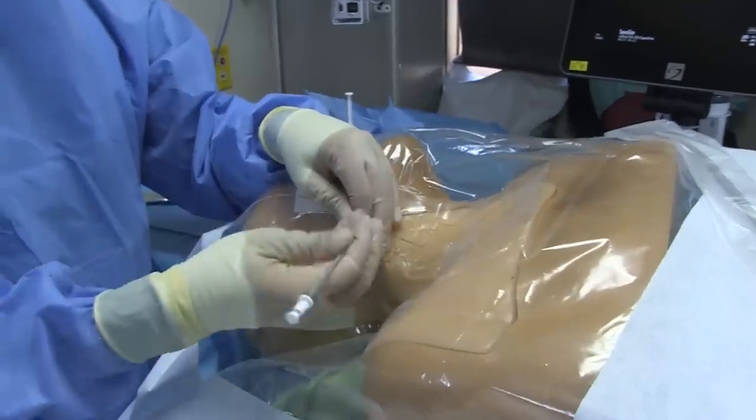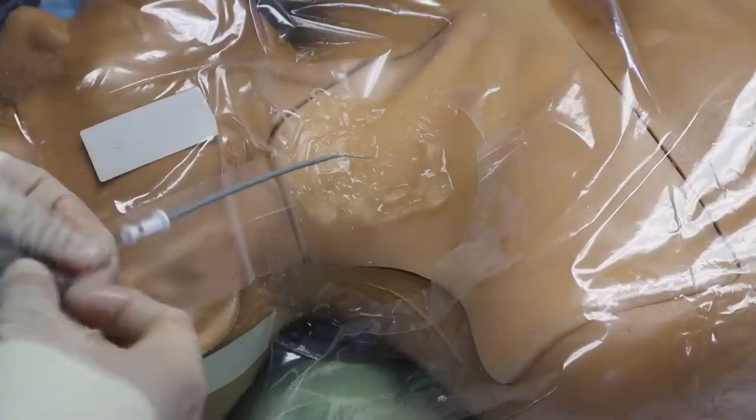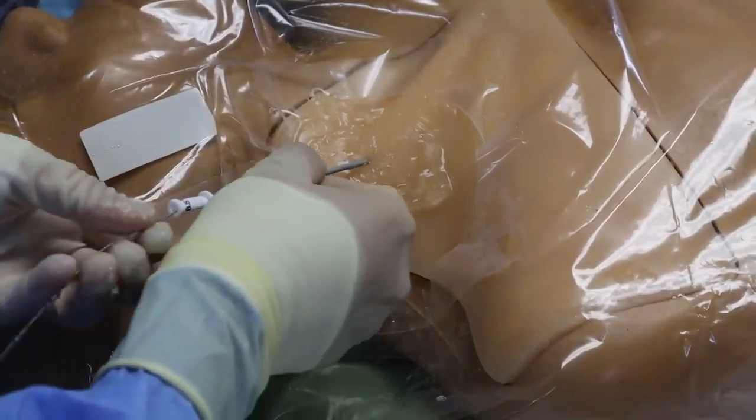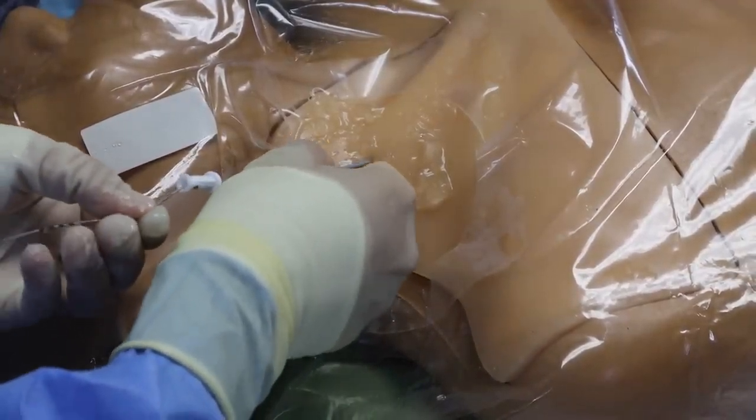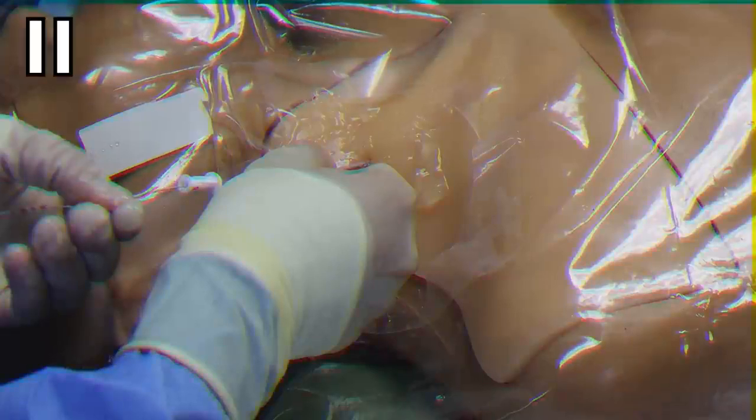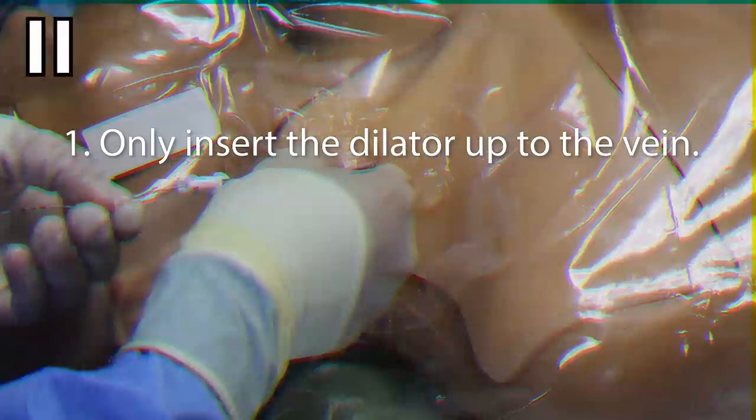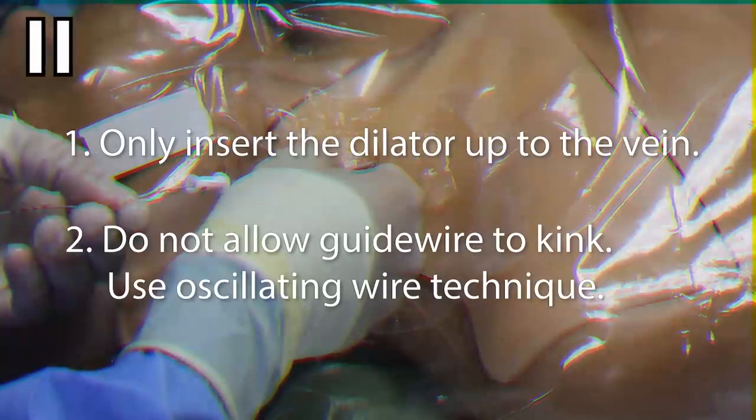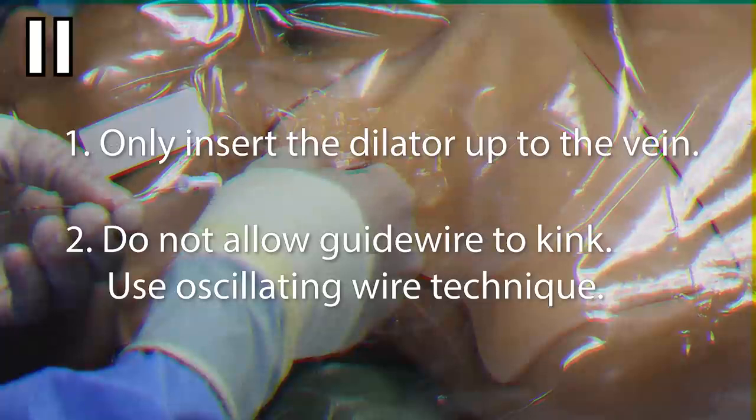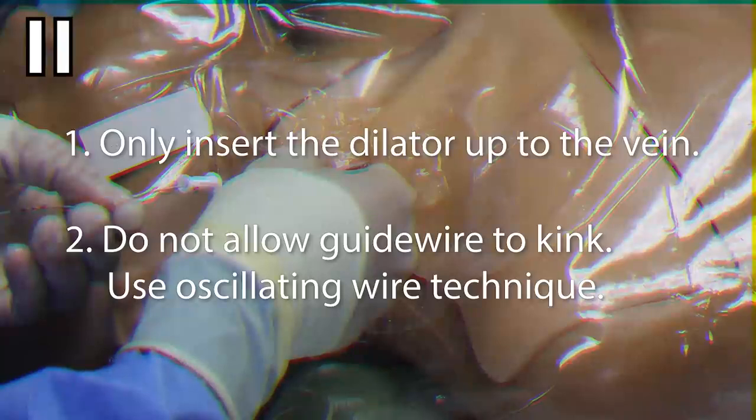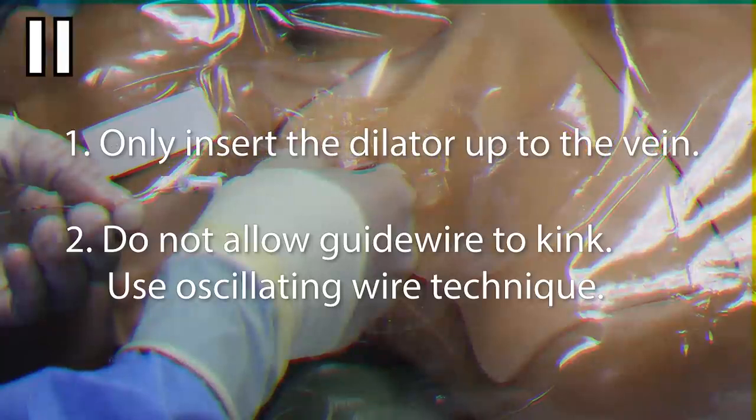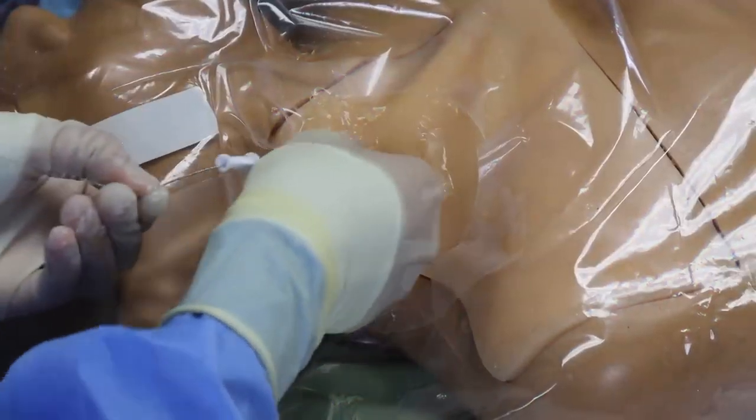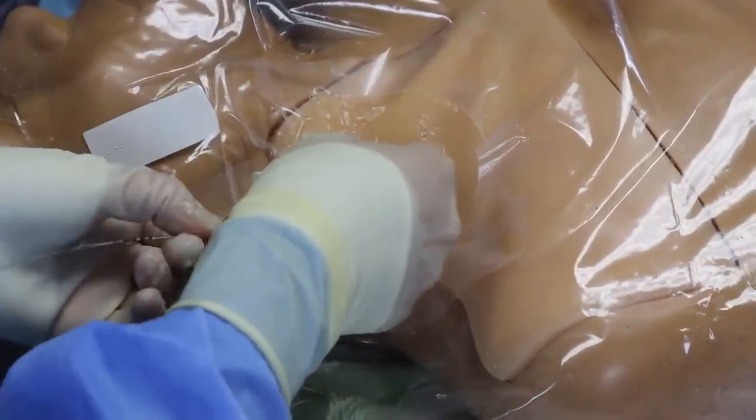Now grab that dilator and feed it over the wire to get it to the skin. Applying firm but steady pressure and with a bit of a twisting motion, dilate the skin and the subcutaneous track. A couple notes about dilation. One, you only need to insert the dilator up to the anticipated depth of the jugular vein which is usually no more than 3-4 cm. And two, you need to prevent kinking of the guide wire as it emerges from the tip of the dilator, which can happen when you try to force the dilator over the wire. A kinked wire can tear the vein. To prevent this, I gently oscillate the wire back and forth to ensure it continues to glide smoothly as I advance the dilator.